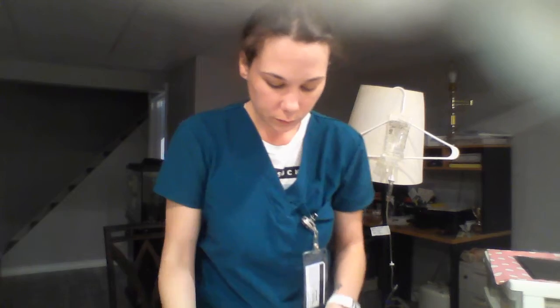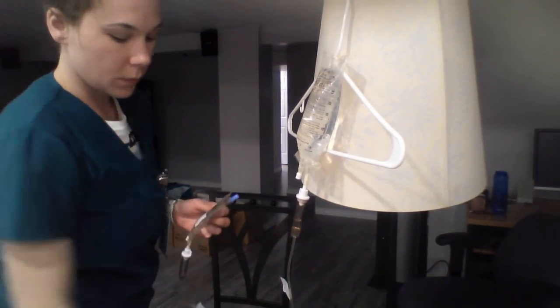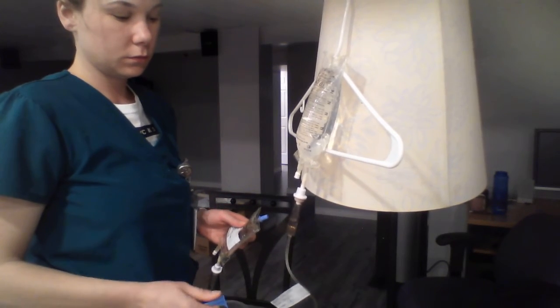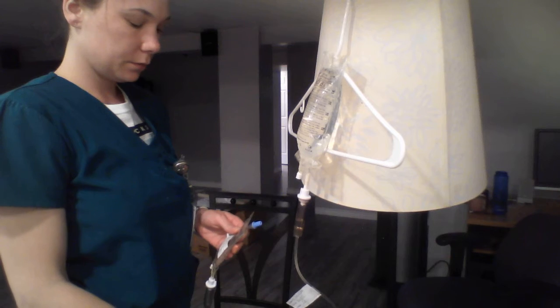Okay. So now I'm going to hook up my line. So do this. I'm going to right away stop the main line. Okay.